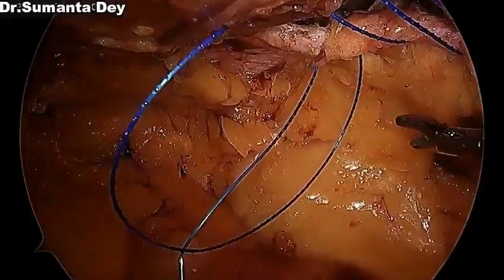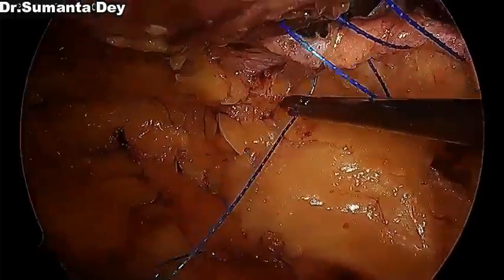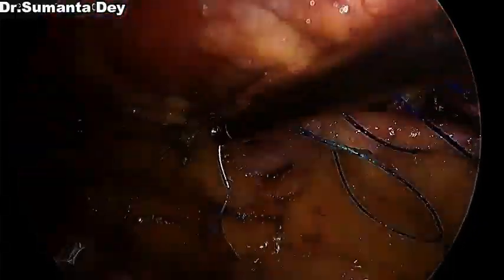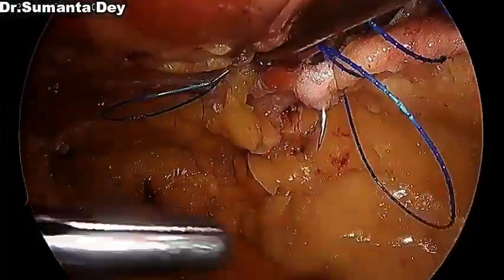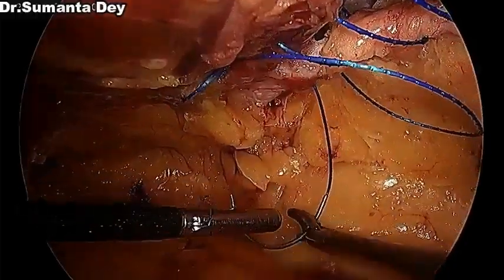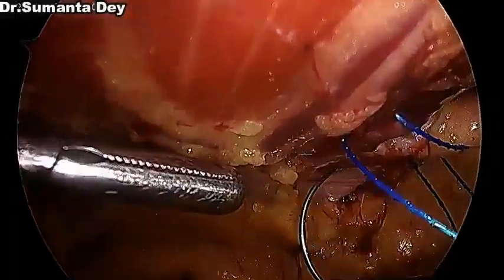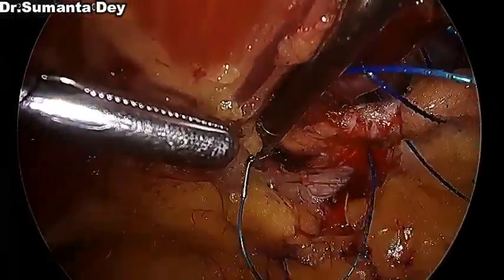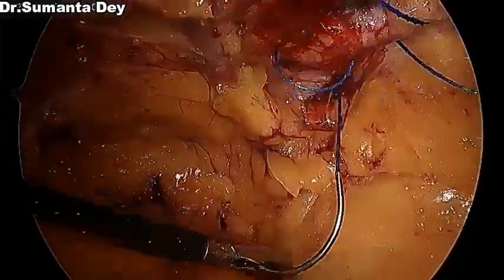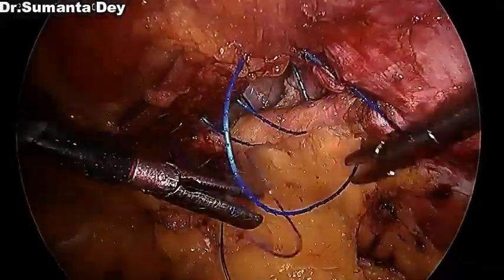First we take all the bites and then we pull the suture. This is one kind of self-locking suture. Once you pull the suture, it will automatically get locked. This is a unidirectional spiral barbed suture. Now I am taking the last bite that is beyond the defect, and we pull the suture gradually to close the hernial defect.